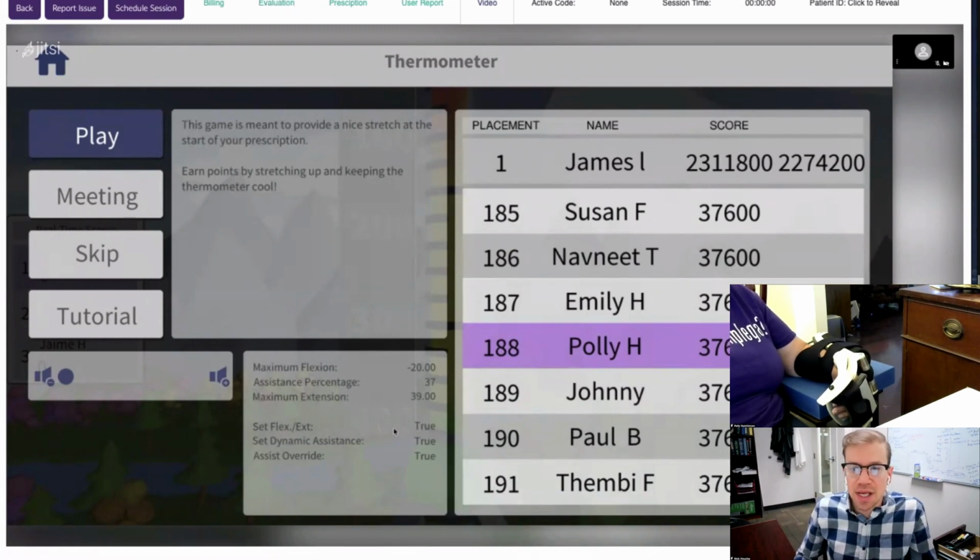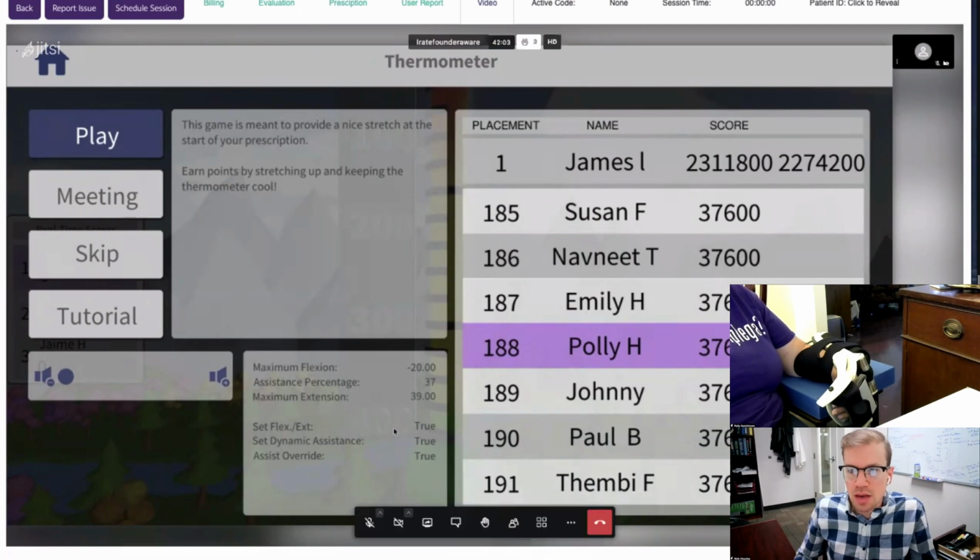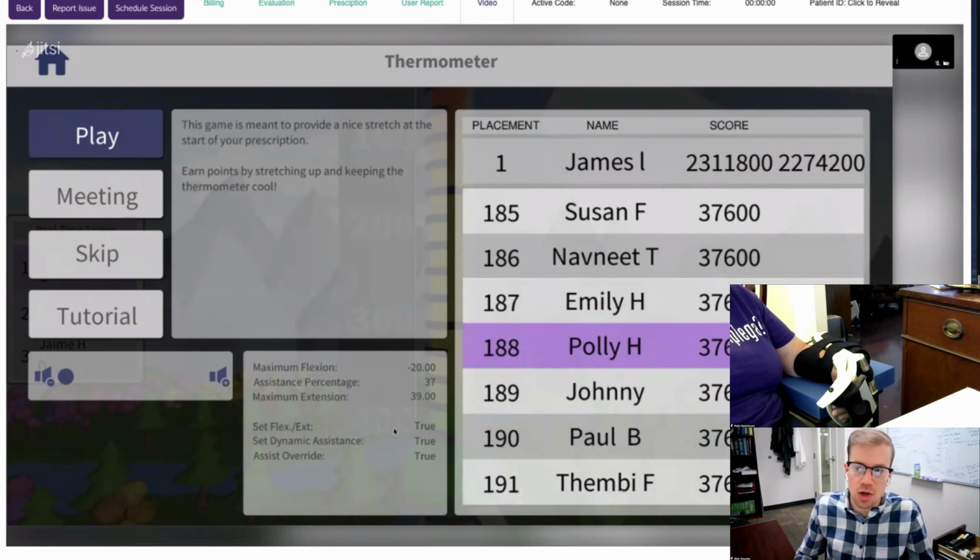Yeah, and I'd say it may appear that way, but when we actually think about how to make generalized rehab interventions, we want to have different ways that your brain is having to control your limb, right? If we just had very simple mapping, up down was exactly up down in the games, that would become maybe less effective long term. So we want to actually challenge the way your brain is having to control your limb. And for you, this is a double challenge because A, you have a rotation in your normal posture, and you're also using your left side. So I'd say it's a bit more challenging than it would be for a right-handed individual, for sure.